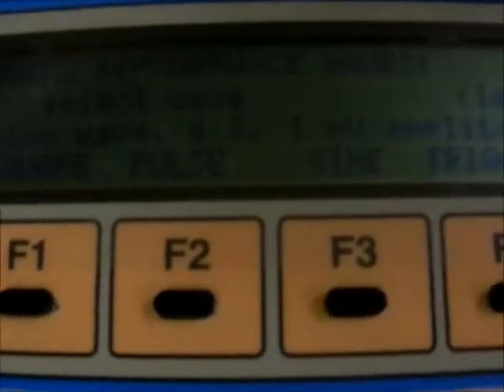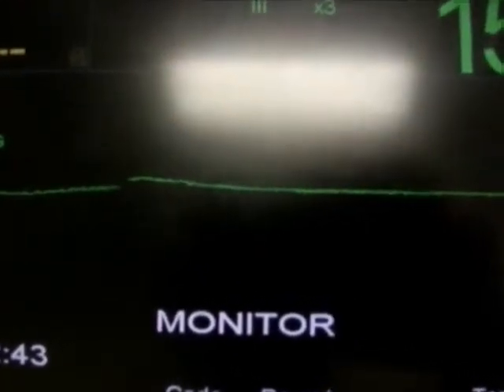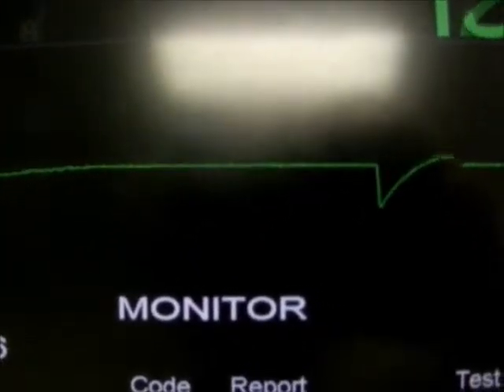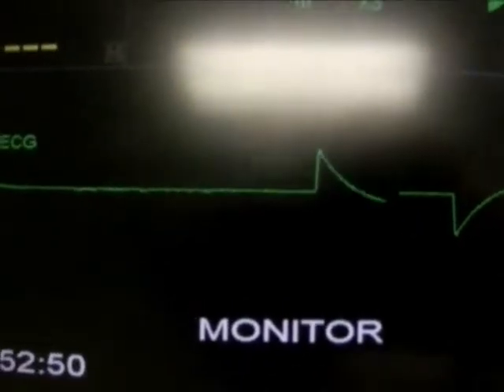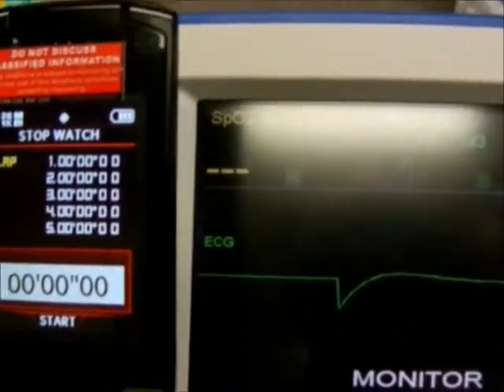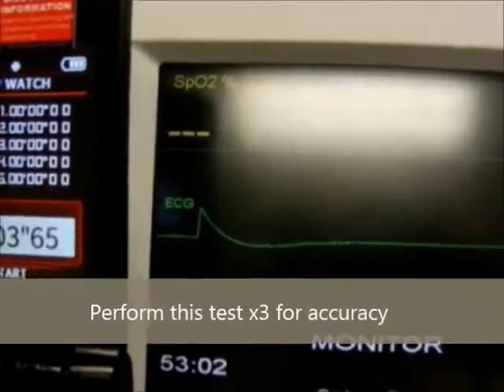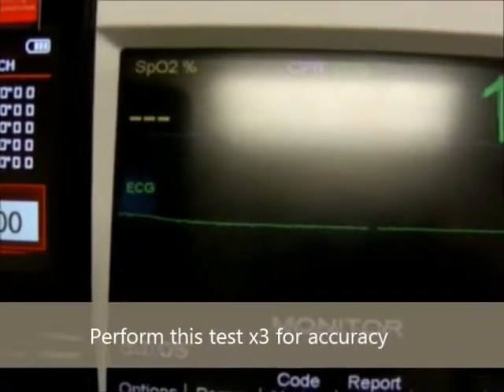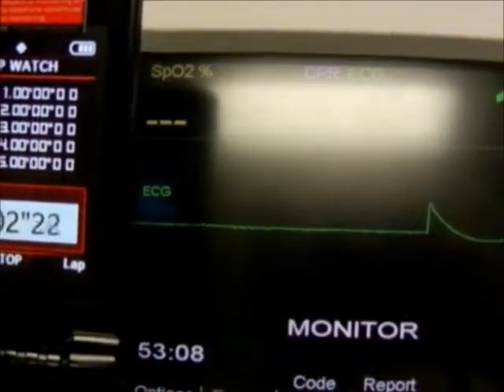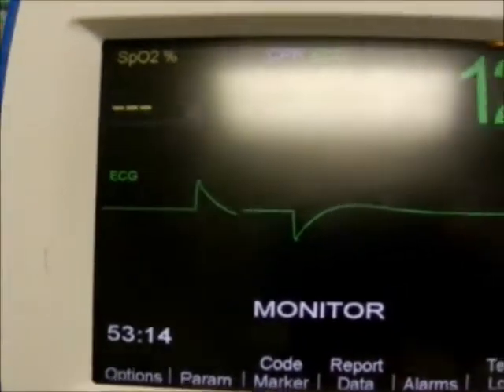Next we will measure the pulse, which is a 4-second 1 millivolt amplitude wave, and here is what it looks like. And actually what we do is measure the time it peaks. So we will measure the next pulse to a stopwatch, and it should be 4 seconds. And let's redo it again. So that's about 4 seconds, which is pretty accurate.